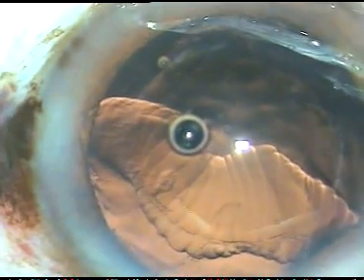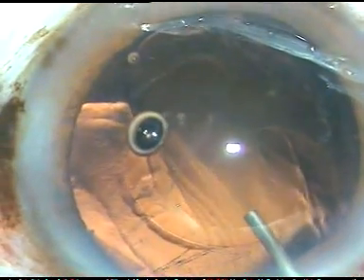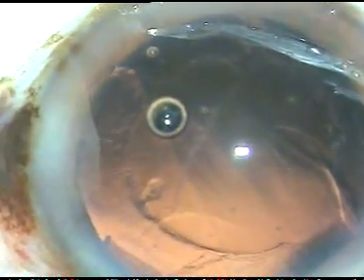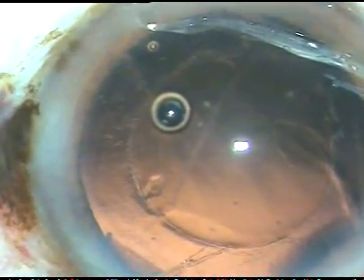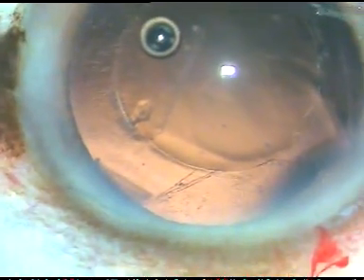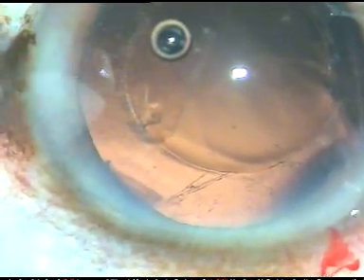Now I inject Viscoat again. And I am going to implant a multipiece intraocular lens in the sulcus. In this case I want to enlarge the main incision by 0.2 mm. And I want to use the B cartridge of Alcon and use a multipiece intraocular lens in this case. So here I am enlarging the main incision a little bit — about 0.2 mm or so.